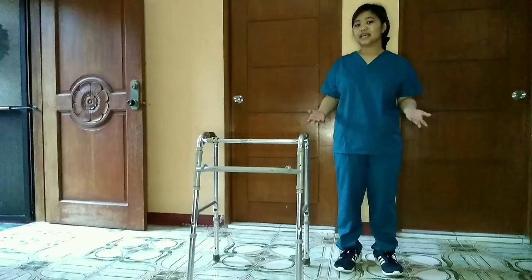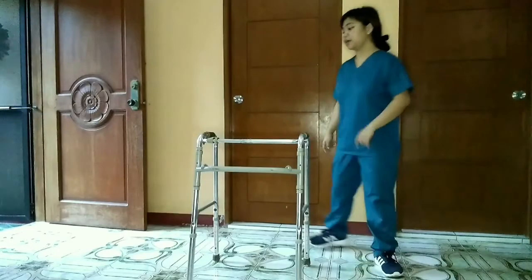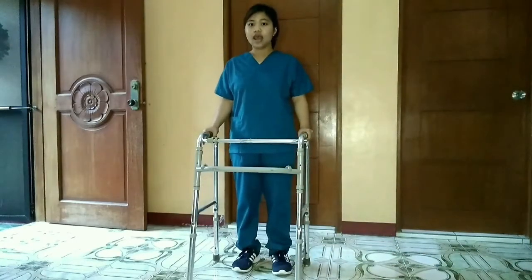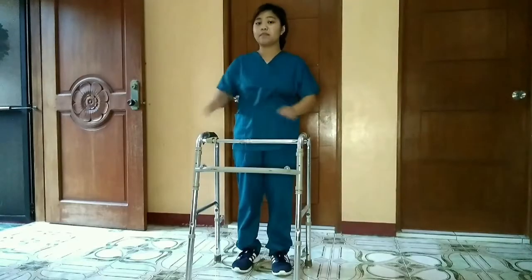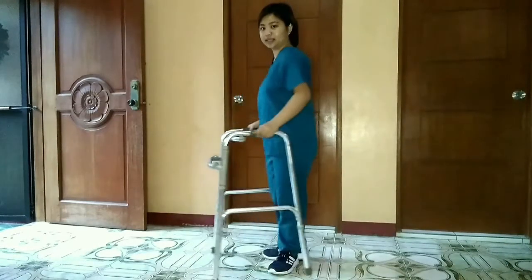Consider also having your patient descend stairs in a sitting position if necessary, moving the crutches down as he or she goes. And lastly, help the patient ambulate with the use of a walker. The first thing that the patient must do is to stand straight in the center of the walker and then hold the hand grips. When holding the hand grips, make sure that the elbows are bent at a 15 to 30 degree angle, like this.